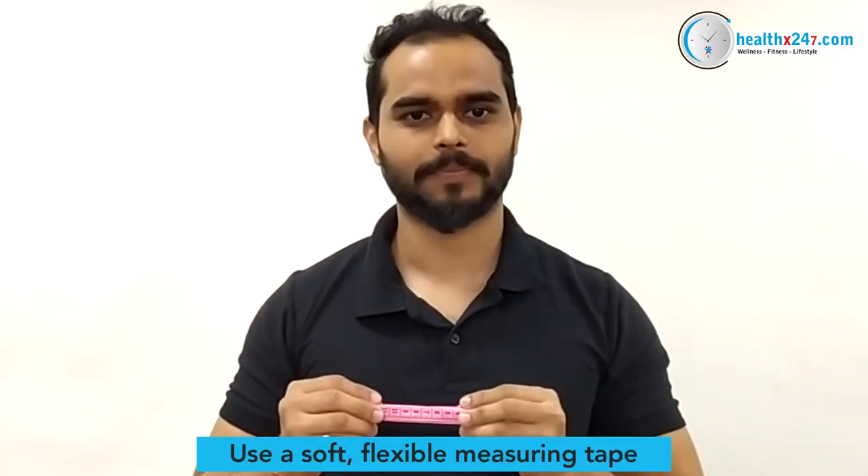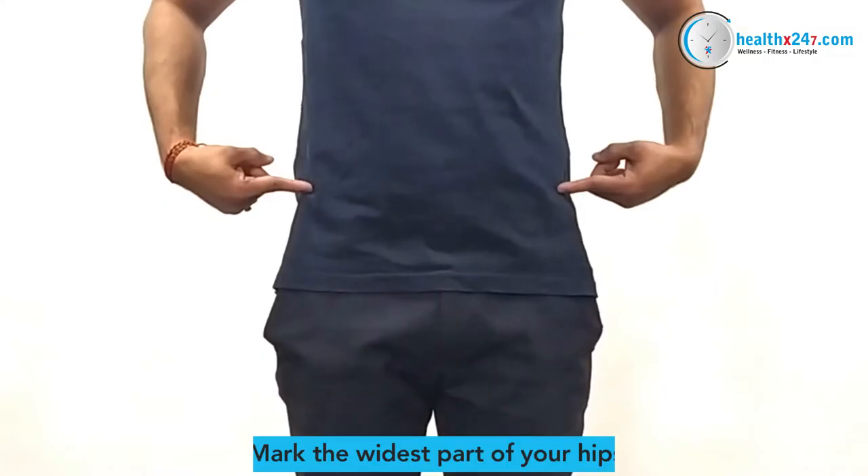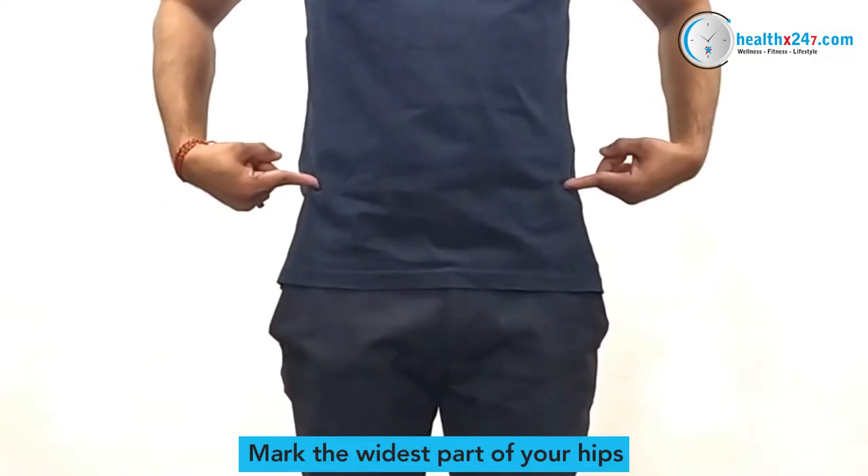Take a measuring tape. Be sure to use the centimeter side of the tape. Mark the hip bone — the widest part of your hip.